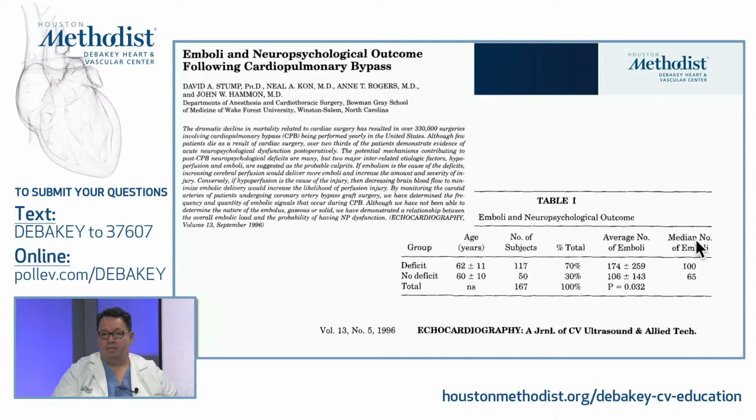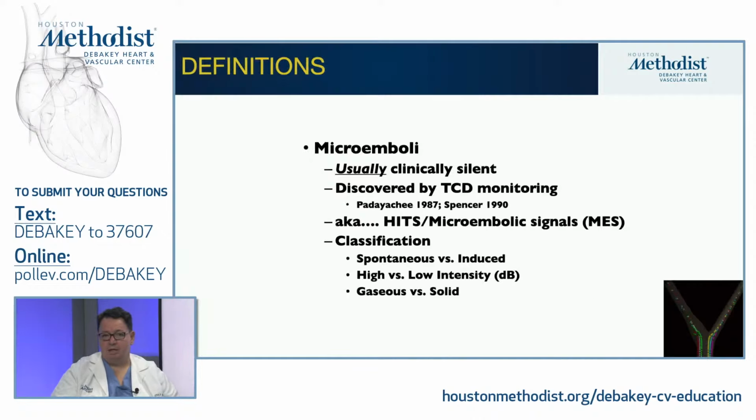But again, the number of emboli, it doesn't matter if it's air or solid. I think the total number of emboli is really what we are looking for, and that looks like it's definitely correlated with outcomes more than 20 years ago. So it must be correlated with outcomes even today.